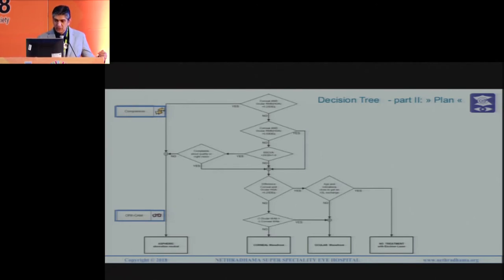It's ideal to do both a cornea and ocular wavefront, and if you see that it is less than 0.25 diopters equivalent, then you can go ahead with just an aberration free or optimized treatment, which is an aspheric treatment. If the cornea and ocular wavefront is less than 0.5 diopters and best corrected vision is better than 20/20, again if there are no complaints of night vision, then you can just go in for an optimized treatment.